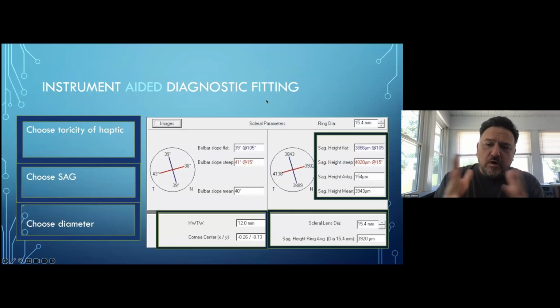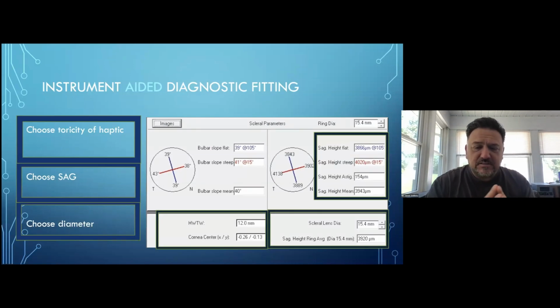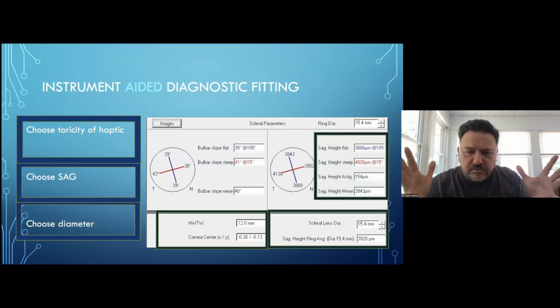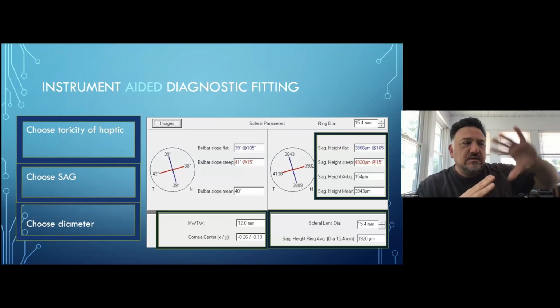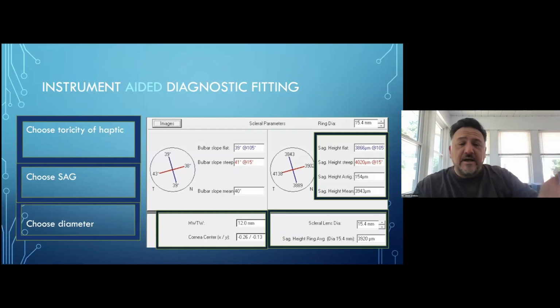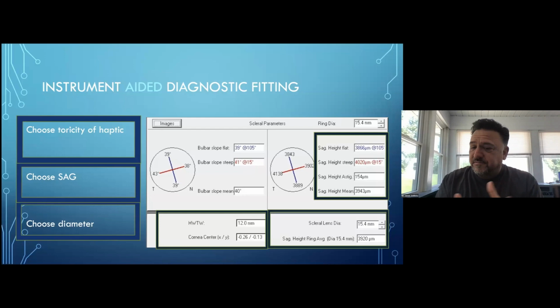So again, what can our scans tell us? They can tell us, in this case, I've got a white to white of 12. That tells me I right away have in my mind what diameter lens I want to fit that patient, based on 12 millimeters and based on knowing the condition I'm fitting, whether they're a post graft or a cone or whatever their condition is. When I know their condition and their white to white, I know in my head generally what diameter lens I'm fitting, because the lens I'm fitting may only come in 3 or 4 options of diameter. And so given my white to white and my options, I will pick the appropriate diameter lens to fit.